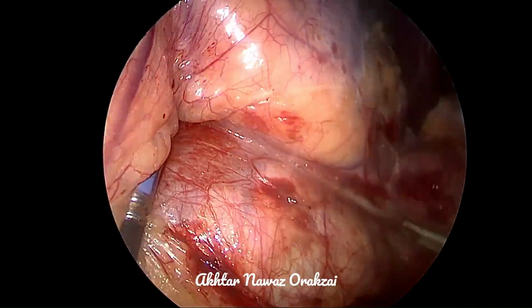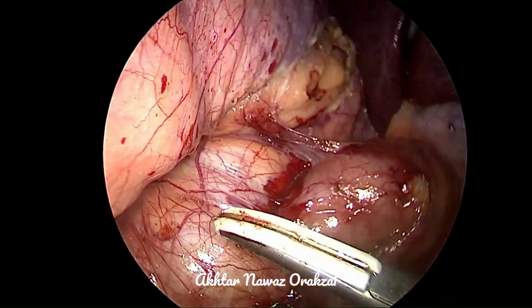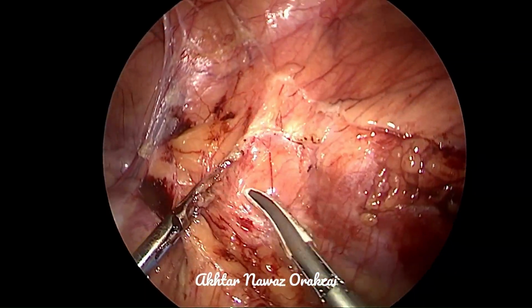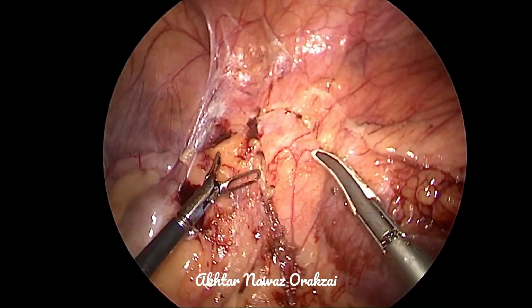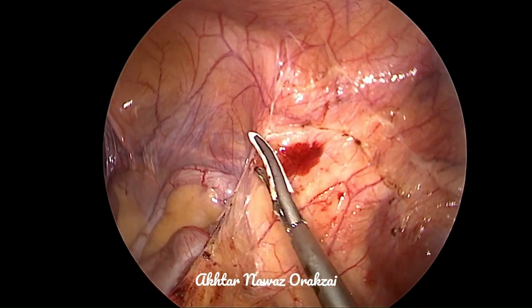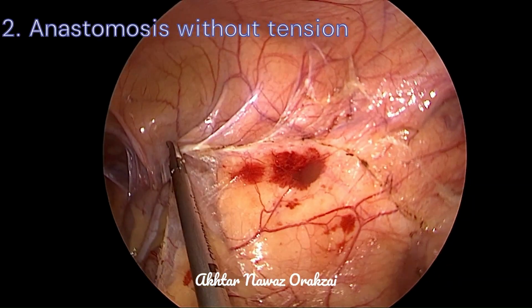So the periureteral sheath is an important thing to preserve during dissection of the ureter, and preserving its blood supply is the topmost priority in any reconstructive procedure, because if the ureter becomes ischemic, there is a fair chance that the pyeloplasty will fail.